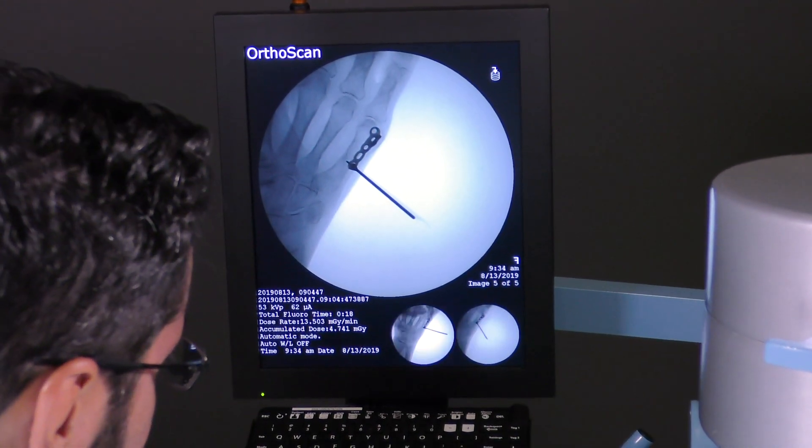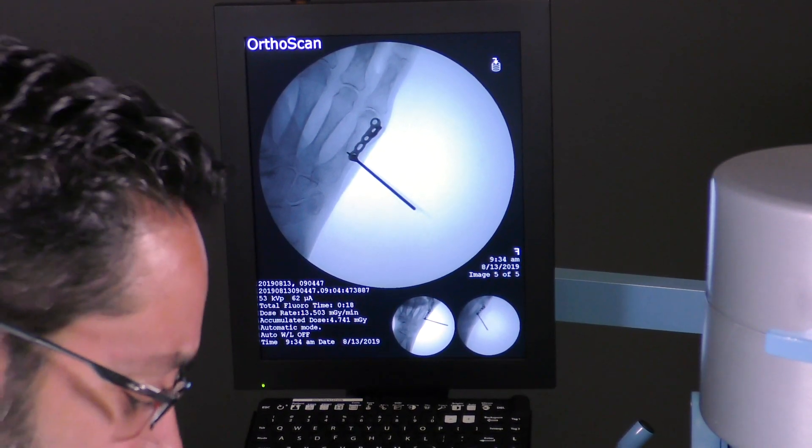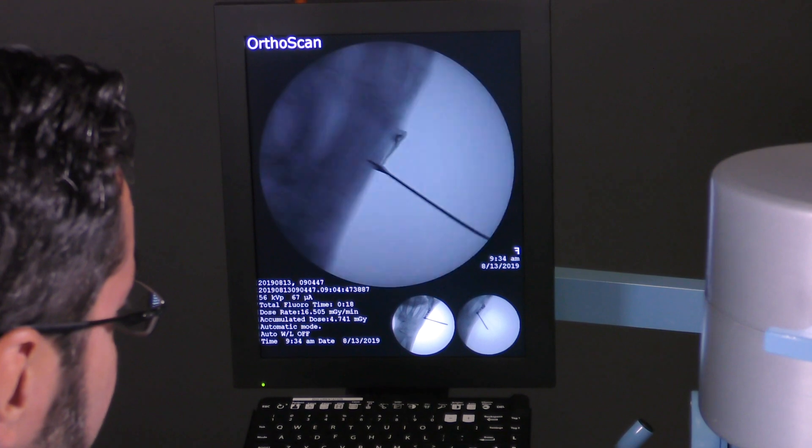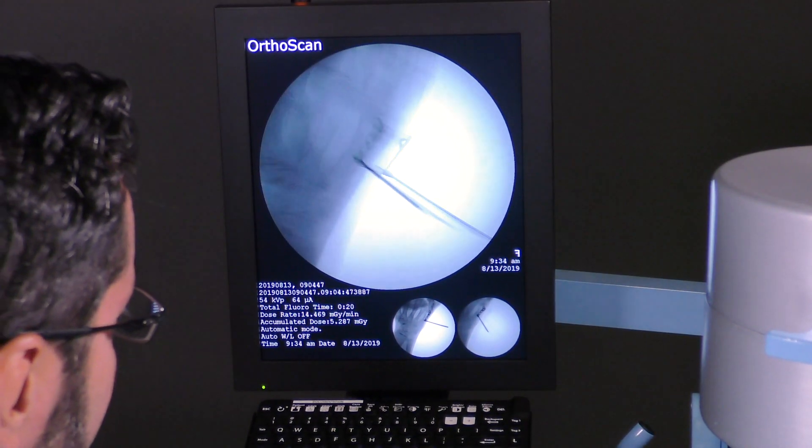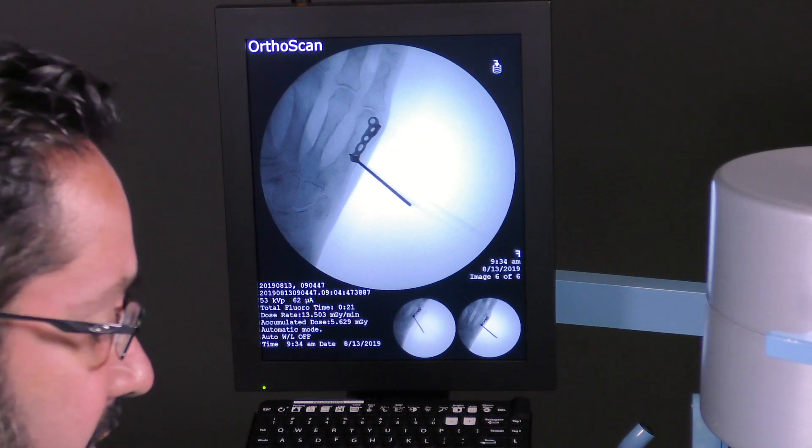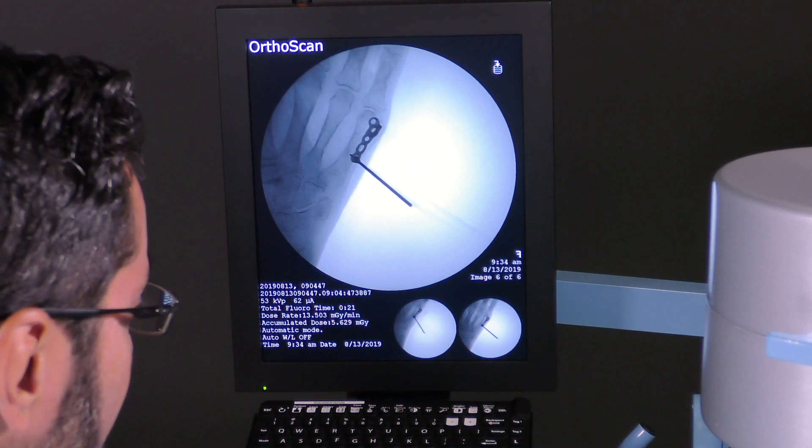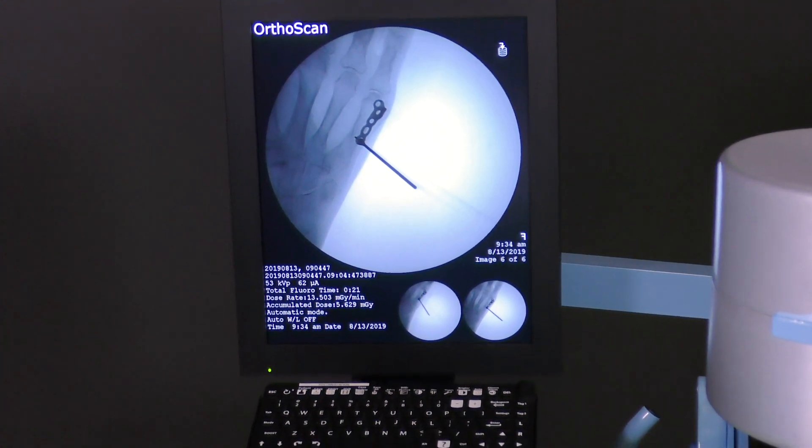If you look at this, the plate's probably a touch distal, maybe two or three millimeters more distal than I would like. So that's fine. What I can do now is I can reposition this all together, and then re-image it. Or alternatively, I can just put a screw in the oblong hole in the proximal aspect of it, and then slide the plate back.